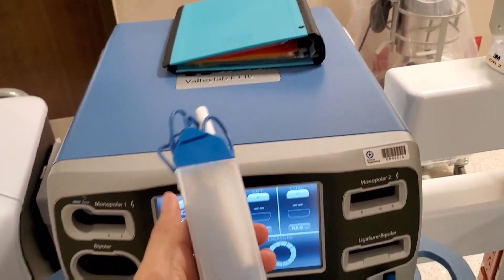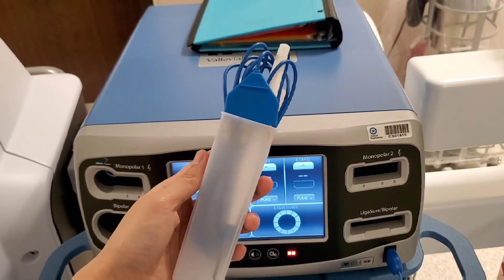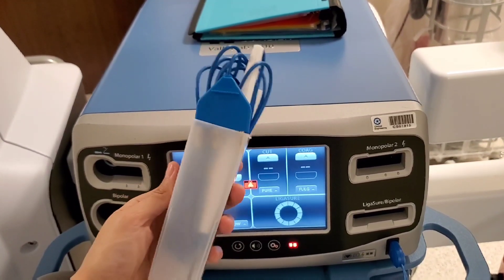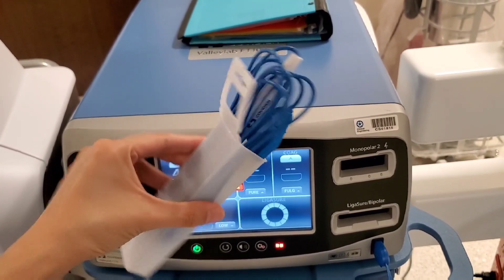Hey guys, I had a cancelled case and part of my pack had a bovie, and I thought I'd take the opportunity to show you how to plug it in, how it works, and what it looks like so you get familiarized with the equipment in the OR.